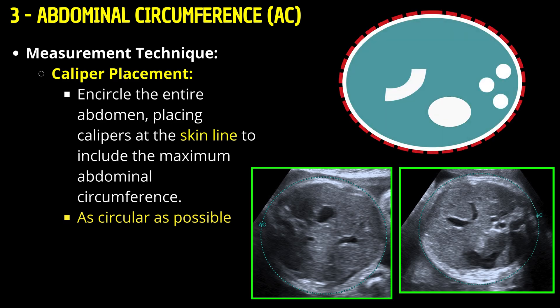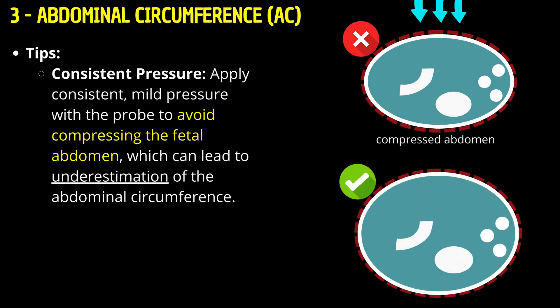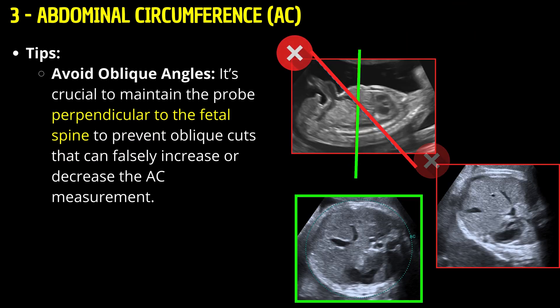Measurement technique for AC: Encircle the entire abdomen, placing calipers at the skin line to include the maximum abdominal circumference. Apply consistent, mild pressure with the probe to avoid compressing the fetal abdomen, which can lead to underestimation of the abdominal circumference. It's crucial to maintain the probe perpendicular to the fetal spine to prevent oblique cuts that can falsely increase or decrease the AC measurement.